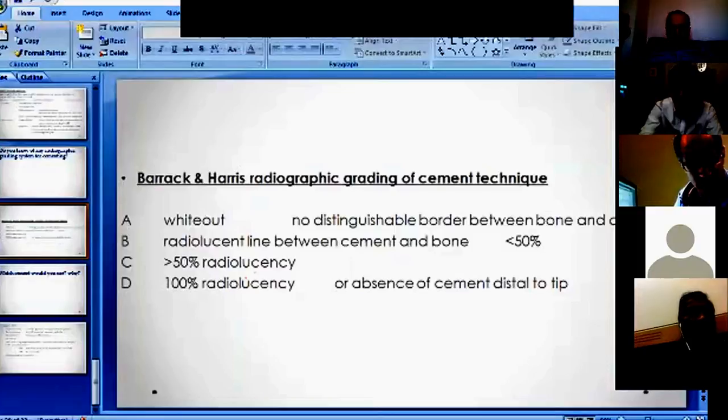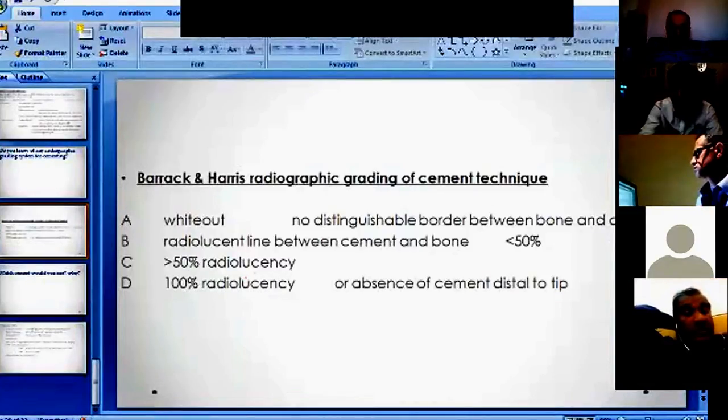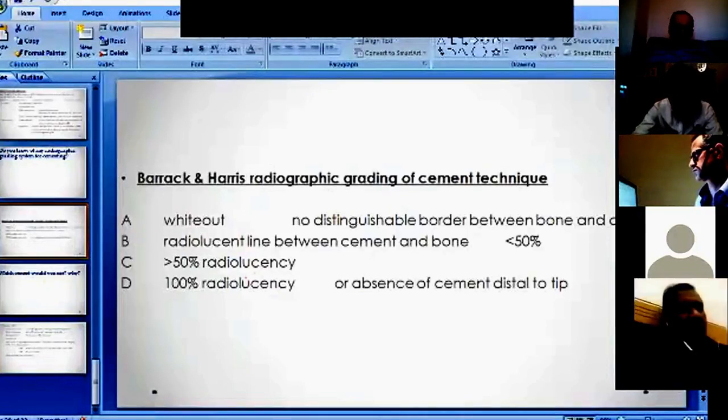Cementation generation is also an important topic to know about. It could be a little bit confusing sometimes, but it's good to be aware of. It's mainly used for the femur anyway. It's not generic. So it's also a good topic to know.